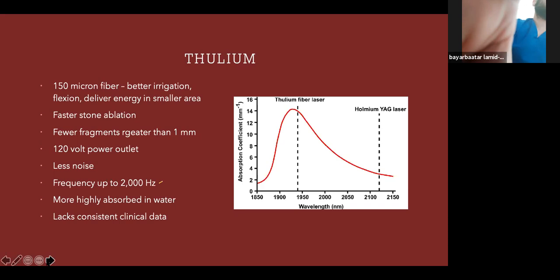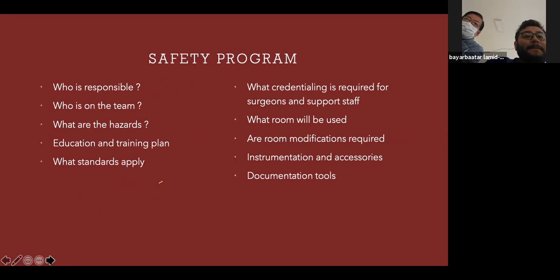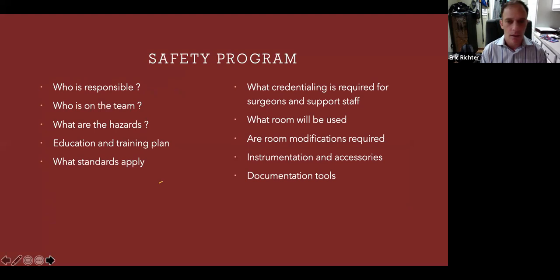Yes, next. All right, so safety, we'll spend some time talking about that. You're interested in that. So with any safety program, you want to know who's responsible, who is on the team, identify the hazards, and have an education and training plan. You want to know what standards apply in the particular environment in which you're operating. Are there local, national, or international standards? Credentialing is required for both surgeons and support staff. What room are you going to place the laser in, as far as access and power requirements? Are there modifications required? And then you want to know what instrumentation and accessories you need, and then documentation tools.